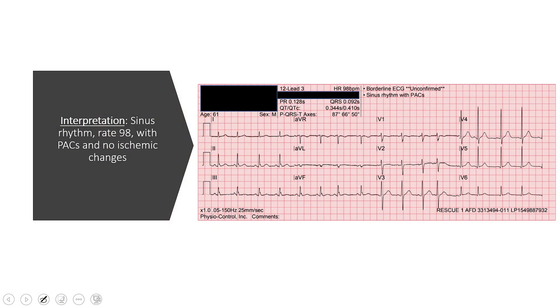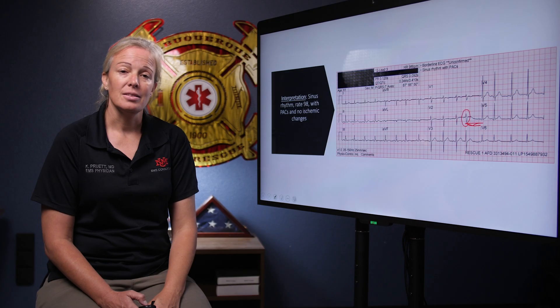So if we look at our 12-lead one more time, now that we know what PACs are, we can start to identify them better. This P wave looks a little different than this P wave, and the next beat that's a little bit early is this one — regular, regular, regular, here's our PAC. The PR is a little bit shorter, we have that characteristic pause afterwards, but a narrow QRS, and then the heart goes right back into its regular rhythm. I would call this a normal sinus rhythm, rate of 98, with PACs and no ischemic changes. And that's all for today.